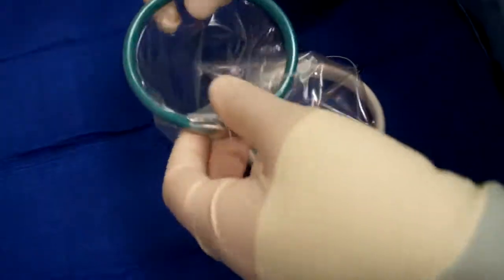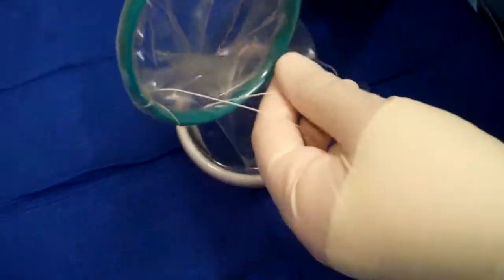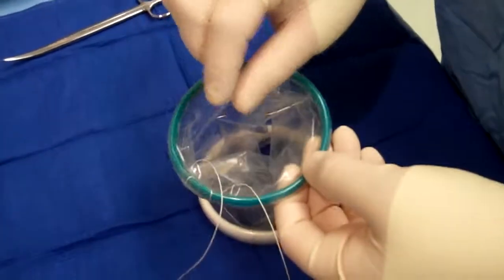I think you had it right the first time. Roll it in. Good. Excellent. There you go. Perfect. Now the tether's covered and the knot's covered. That's perfect. So now we have a tether that like we have on the gel point mini.